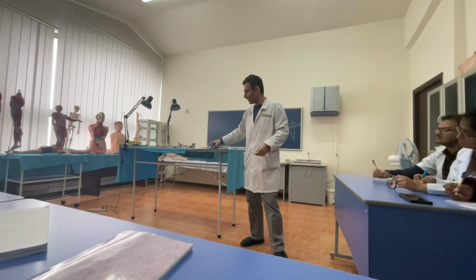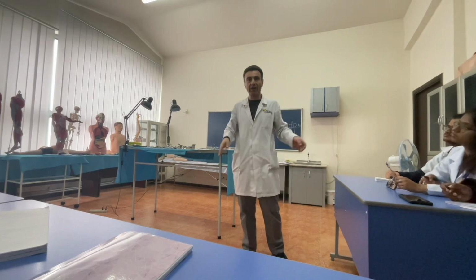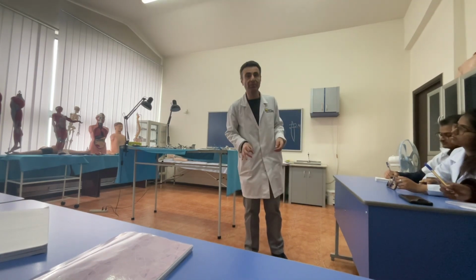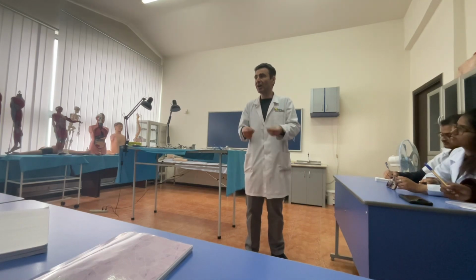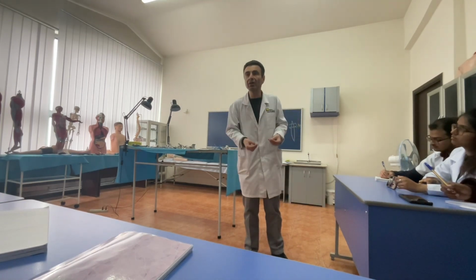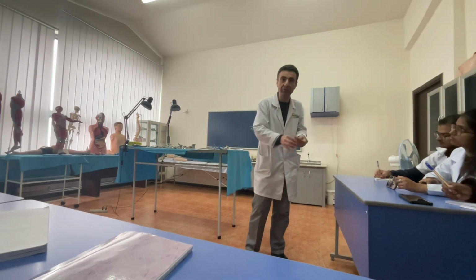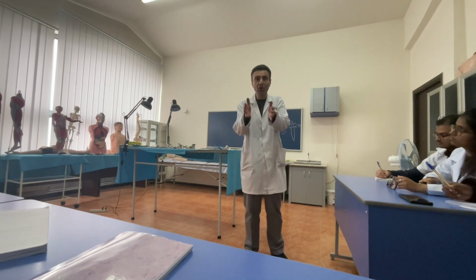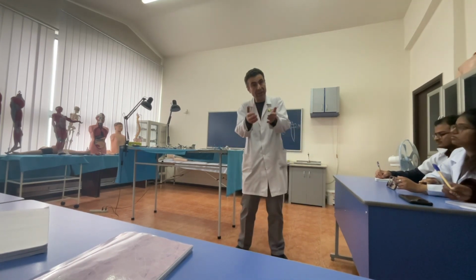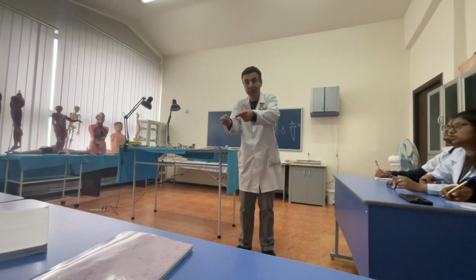Inside of the wound, I can use coagulation. It is also a permanent method, forever arresting bleeding. Inside of the wound, I can use hemostatic sponge. That is a special sponge made from collagen or fibrin. It is like glue. You cut a piece and put it in the bleeding place. It glues, closes the lumen of the vessels and stops the rest of the bleeding. All these methods which I told you are permanent methods inside of the wound.